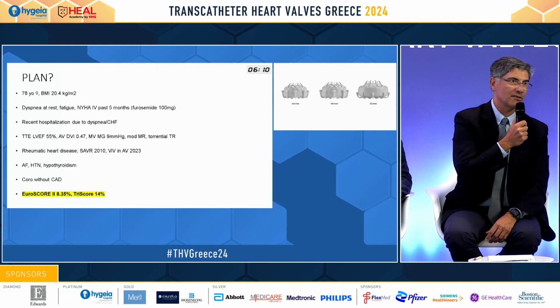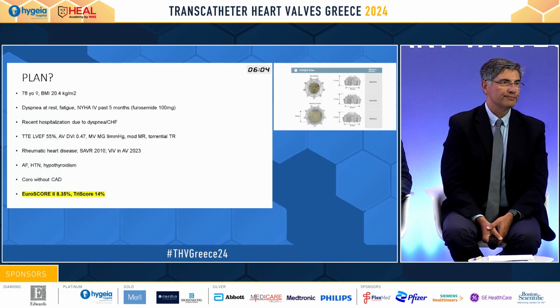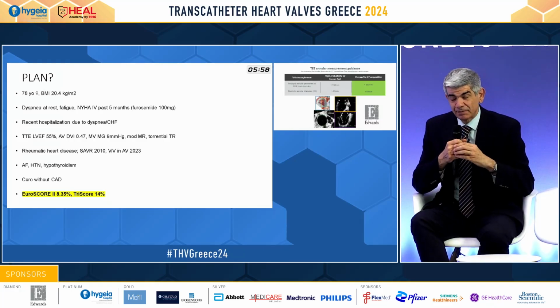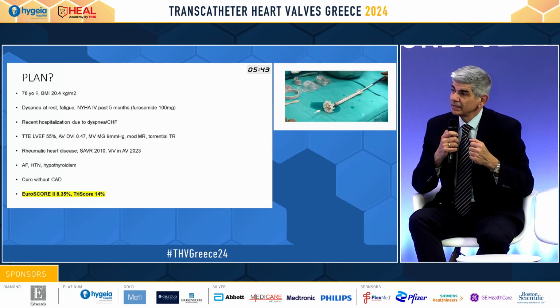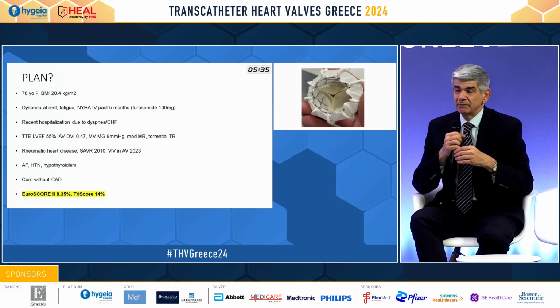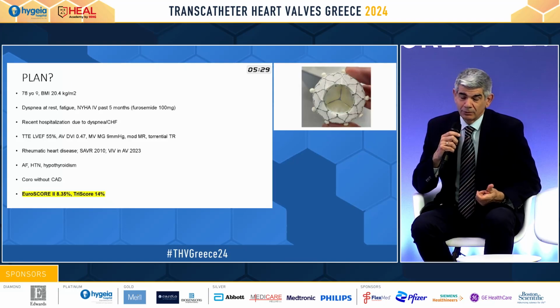How would you fix the mitral valve first? Would you do that? I think as of now, based on hemodynamics and so on, we've qualified it as moderate. One could do an MV area assessment by transesophageal echo and see what the number actually is. But definitely you have to consider that this mitral valve is causing trouble here. But we don't have any good devices for the mitral except for a Tendyne valve, which would be a transapical device, should the patient be a candidate. Overall, the heart team evaluation was that the mitral valve at this point could be on hold.